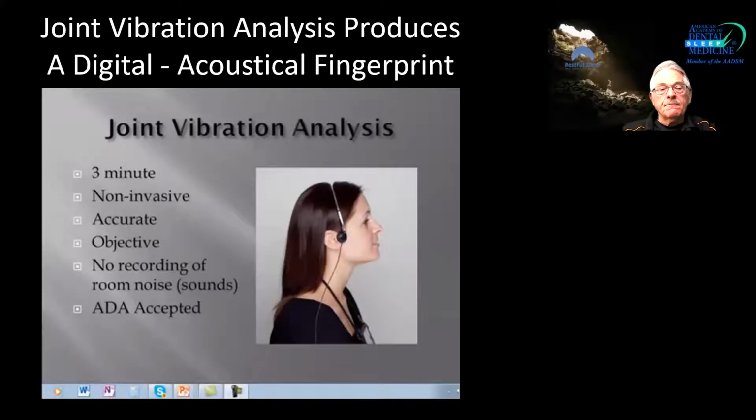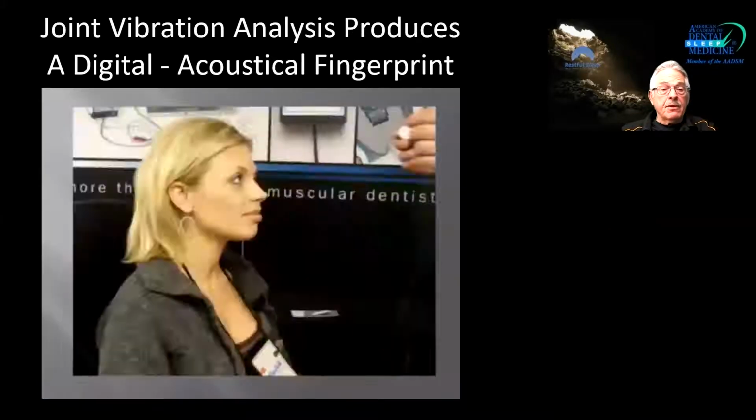So, on one side of the coin, I've kind of said you can somewhat ignore TMJ problems if you're doing sleep. Well, that doesn't mean you can ignore pathology that is causing a TMJ problem if you're doing sleep. So you've got to strike that balance there. But this is a quick example here of digital sonography.